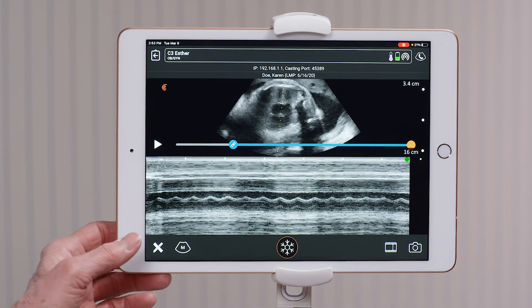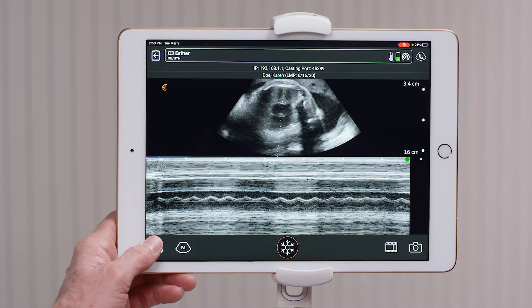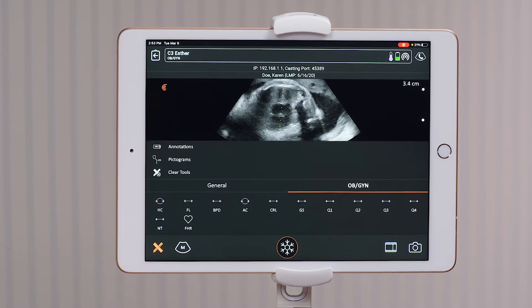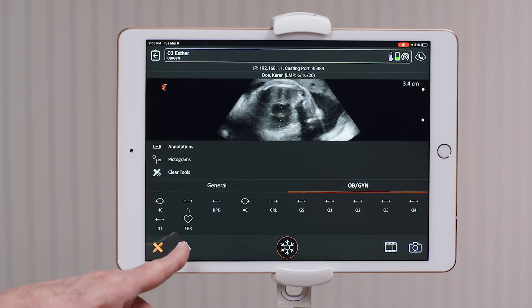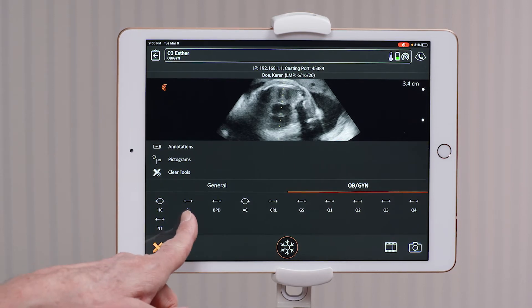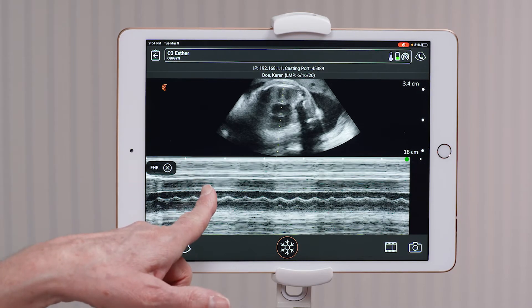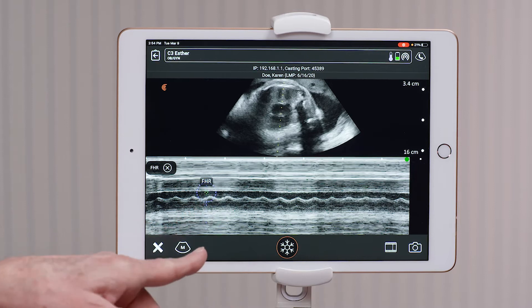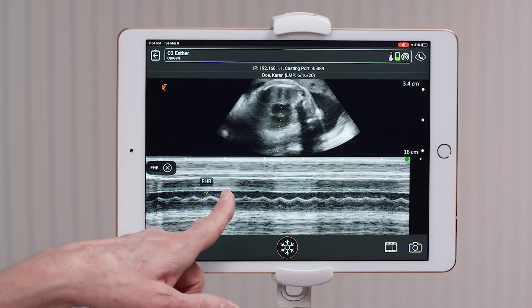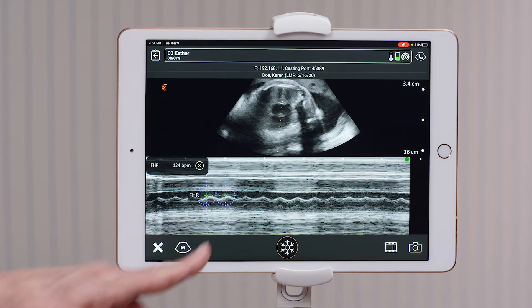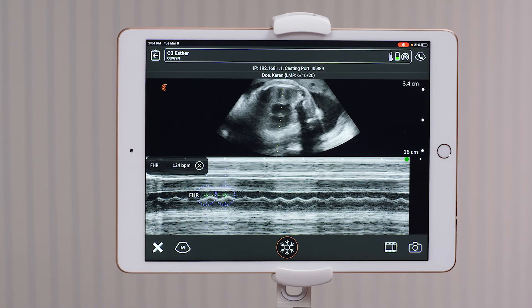then you go to your measurement tools and select fetal heart rate. Then you would measure from peak to peak for 124 beats per minute.